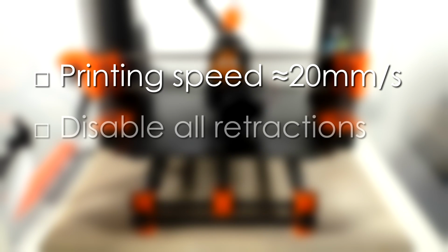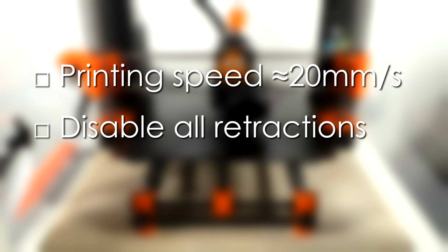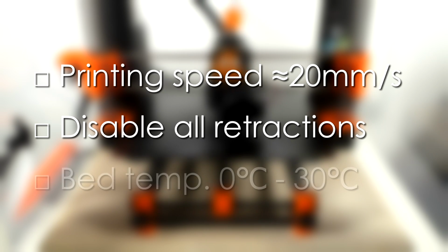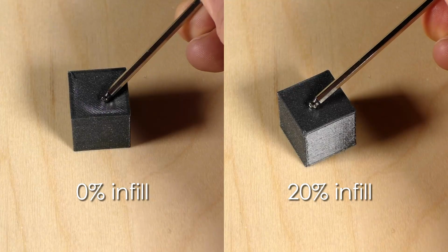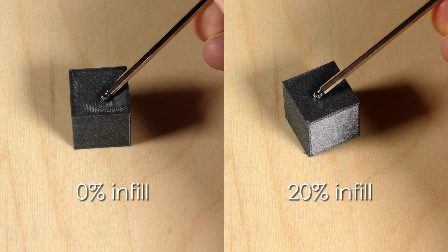Next, disable retractions completely. The filament is too soft to be pulled in and out reliably, and you'll just end up with a mess. The bed should be at around 30 degrees. Anything over might soften the filament too much. Some brands might require a high temperature, but most don't. Adding more infill will make the part less flexible.